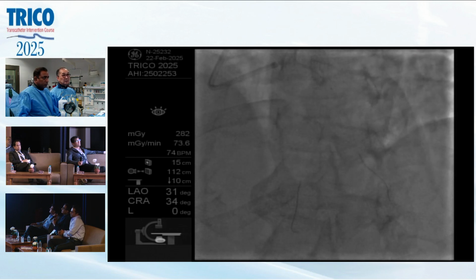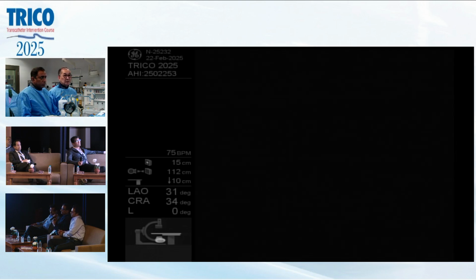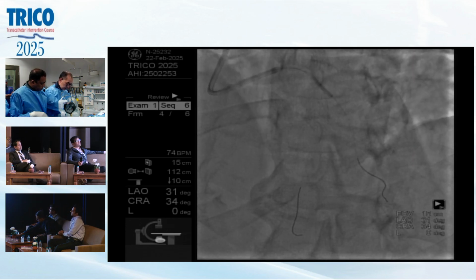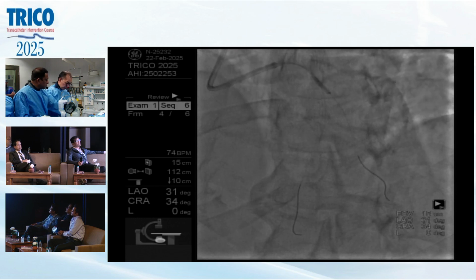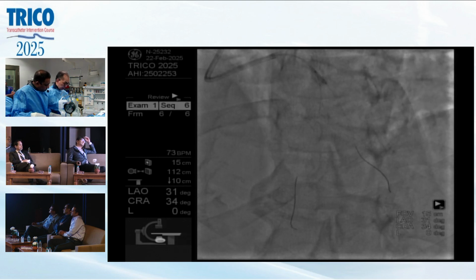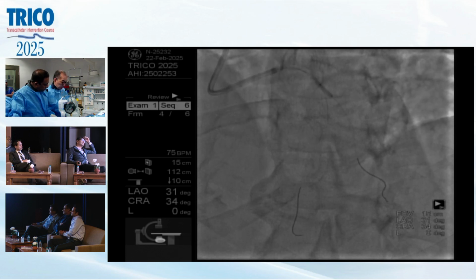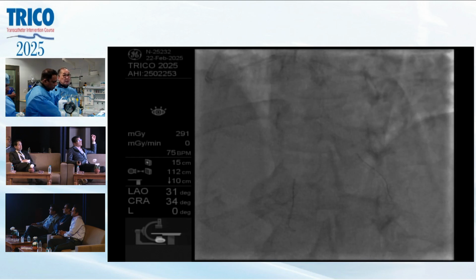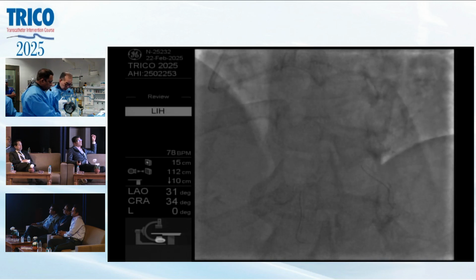So if he's a young patient, I would try to use one stent. If he's old, there's still a lot of discussion. For the bifurcation approach, after 20 years, everyone's still talking about what we should do for a good result. I'm sure you know the recent study about the bifurcation, the DCB trial for the side branch.